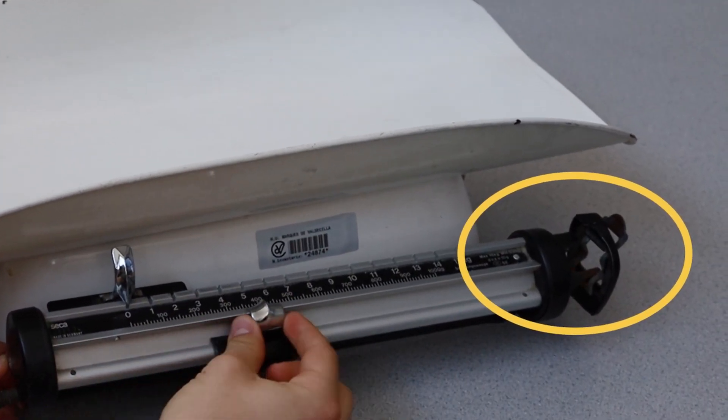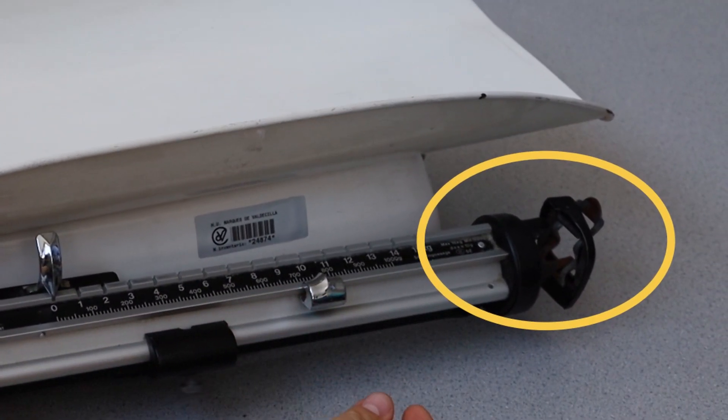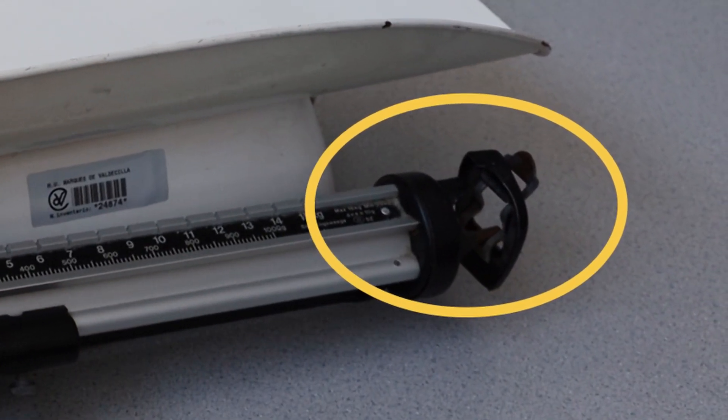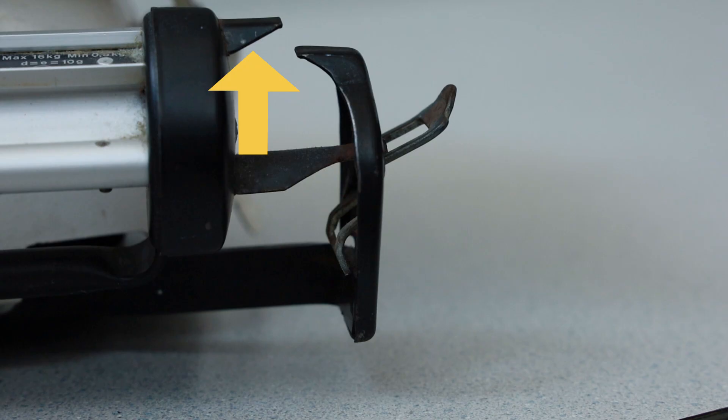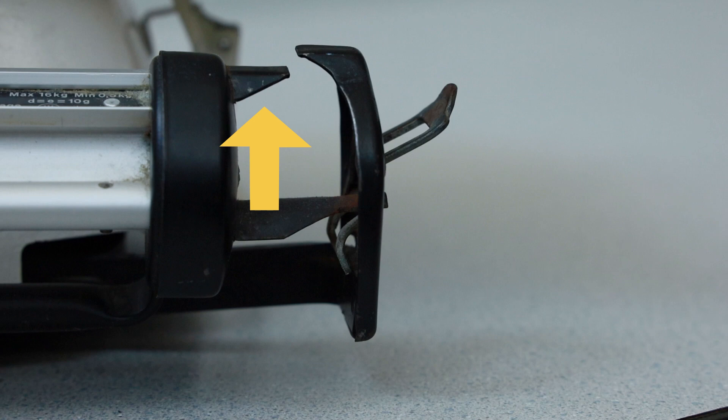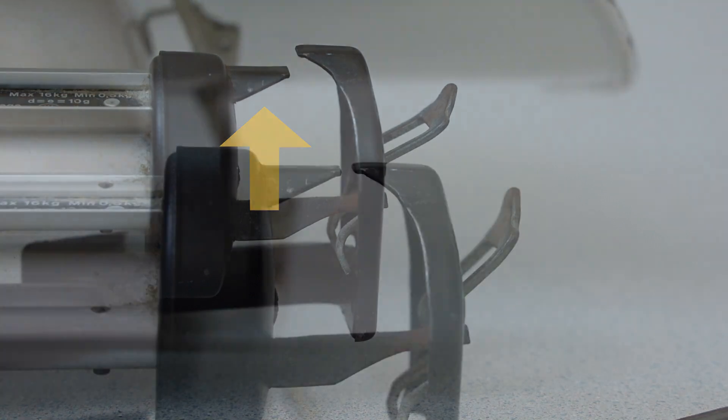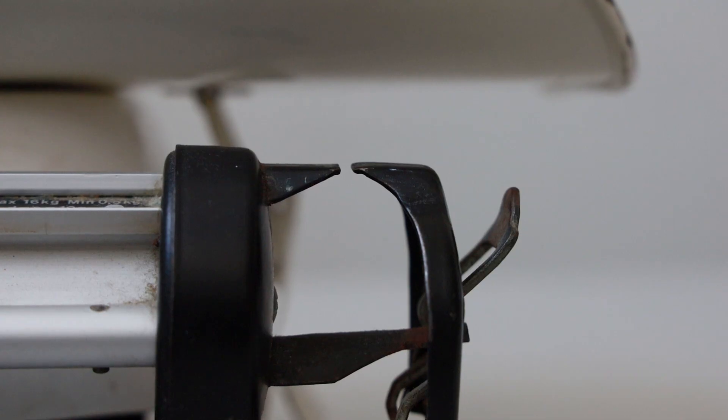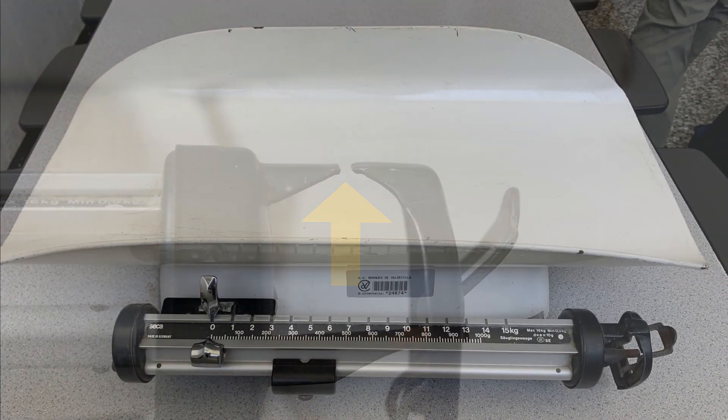The beam balance moves up and down and shows whether the position of the sliding weights match the baby's weight. When the beam is high, the baby is heavier than the sliding weights show. When the beam is low, the baby is lighter than the sliding weights show. When the effect of the unknown infant weight and sliding weights match, the beam balance will be horizontal and the pointer and counter pointer level.